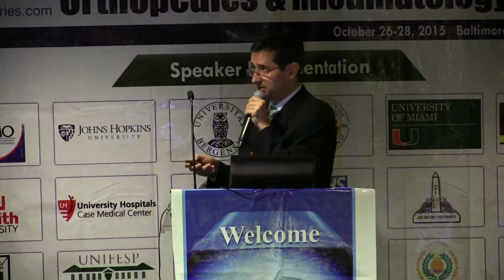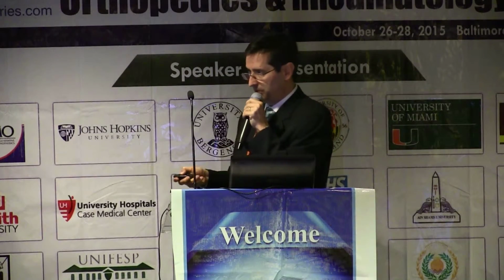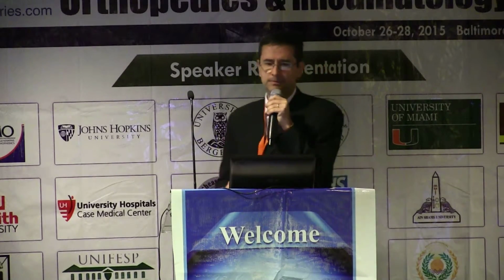In these images, fibroses are seen as hypoechoic nodules adhered to the median nerve. In another patient, fibrosis compresses the nerve, which appears hypoechoic and tapered.